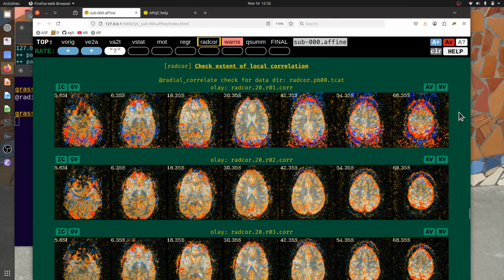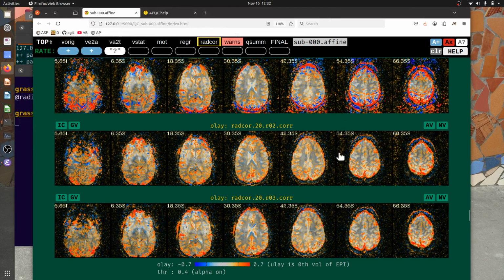And as we see here, let me just scroll down a little bit. For the 3 runs here, we notice that we see some kind of similarities and differences. The similarity is all around the edge is where we see the brightest color, the most opaque. And what we'll notice here is that we're using the alpha transparency threshold again, thresholded at 0.4.